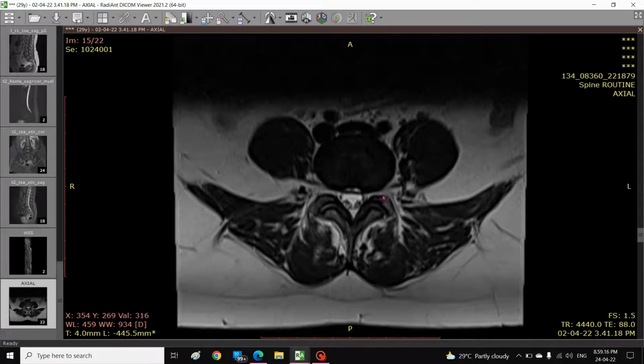But what we see in the MRI does not necessarily have to 100% correlate with the symptoms of the patient. Still, we use the MRI to make some diagnostic patterns and clinical decisions, and to identify what could be the source of the pain, what kind of severity or compression, where is the locality of the compression, and which disc is bulged. So these are some of the clinical reasoning that we do based on the MRI findings.